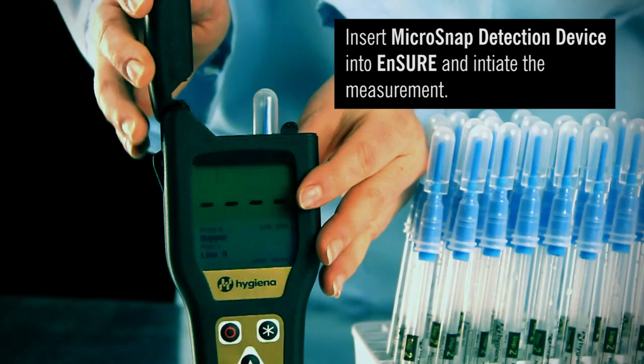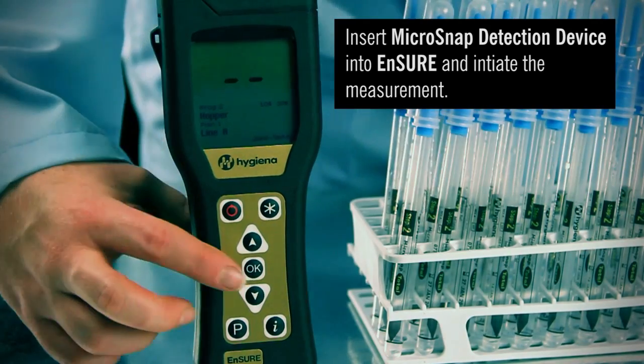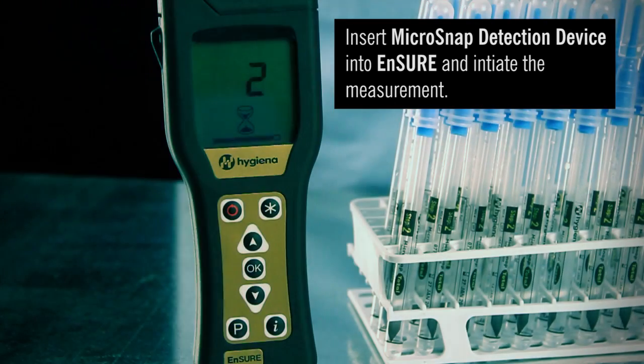Immediately insert the MicroSnap detection device into the read chamber. Close the lid and press OK to initiate measurement. Results will be displayed in 15 seconds.